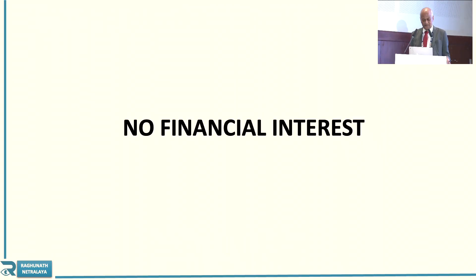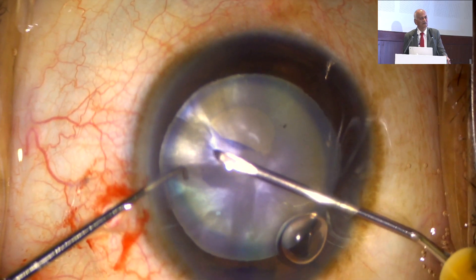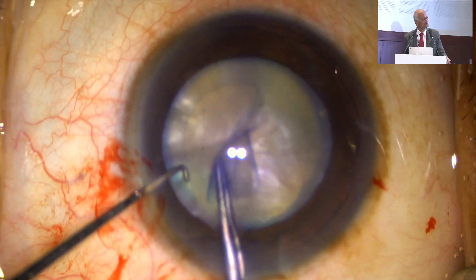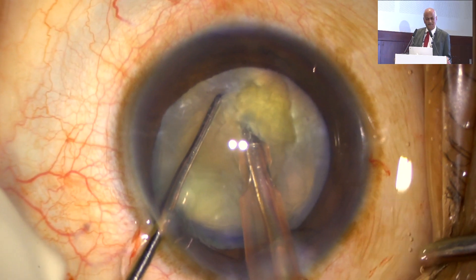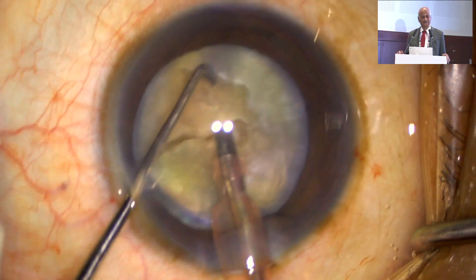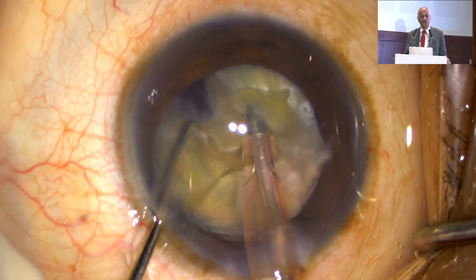In the era of FECO, I am not having any financial interest with any company. Now this is the cataract that I am doing — see the rhexis I am doing here. Whenever you are doing rhexis in such cases, it goes to the periphery. This is a slightly larger rhexis. Why? Because if the bag is small and when you are making the pieces, the bag gets torn from behind — the posterior capsule side. So if the bag is larger, it opens in front and the pressure is distributed in front, not on the posterior capsule.